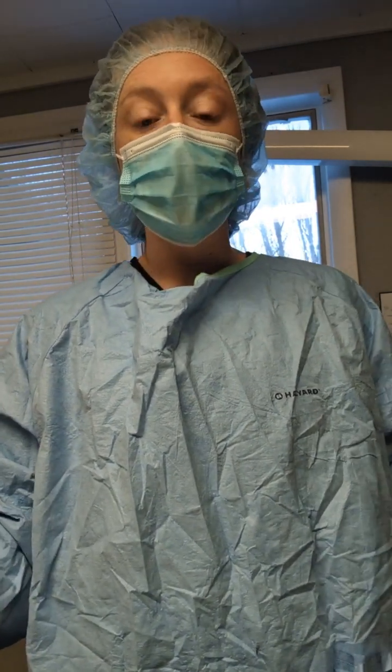During surgery, it is important for the technician to make sure that we are ensuring sterility while supporting the surgeon. So we want to make sure that we are arranging all of the instruments in a way that makes it easy for them to access, and make sure that we count them so that we don't lose anything or leave anything in a patient. So if something is dropped, we just need to leave it on the floor. Hopefully we can continue without it. If not, we would want to do a quick sterilization if that is a necessary tool.